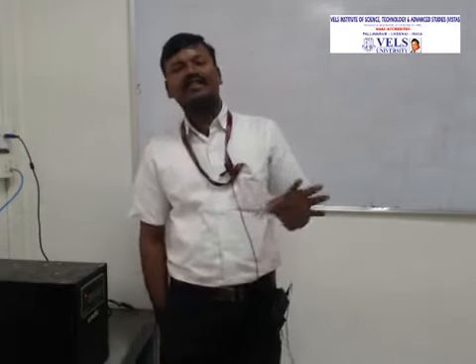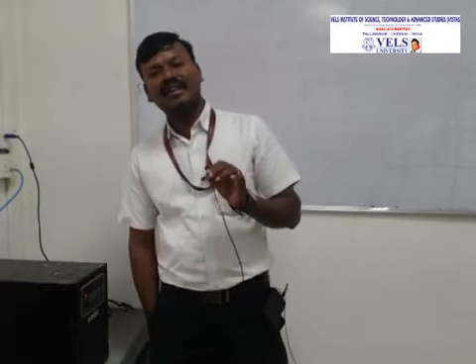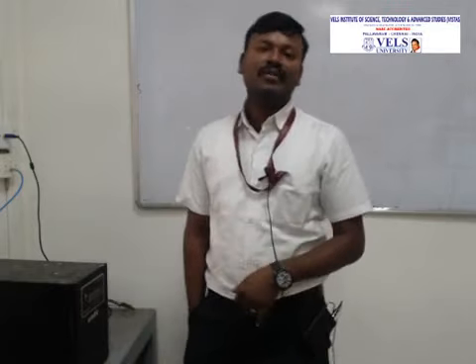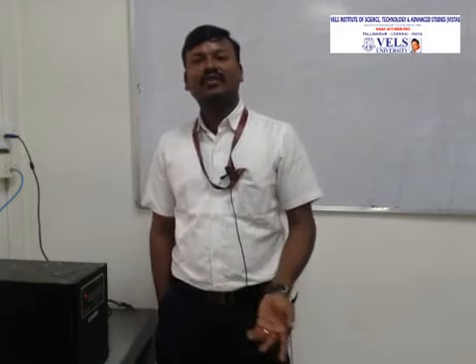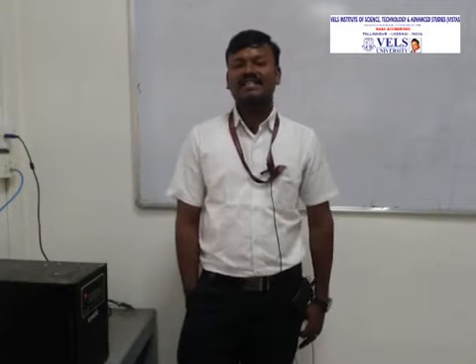The laser is usually fired 3 times to produce a small hole. That is the reason: when you are using a laser, we have to do it only 3 times. If you do more than that, then the zona pellucida will rupture. So it is destroyed, and then there is no use of doing micromanipulation. And next, the importance of laser assisted hatching.